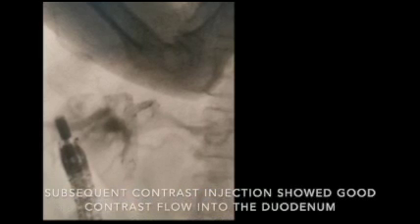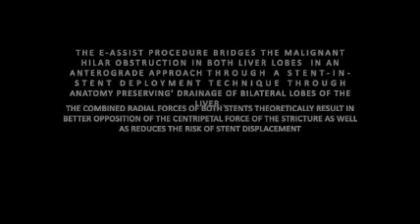After this, another 6 cm uncovered metal stent was inserted into the previous metal stent in a Y fashion with their distal ends overlapping each other. Subsequent contrast injection showed good contrast flow into the duodenum, indicating a successful procedure.